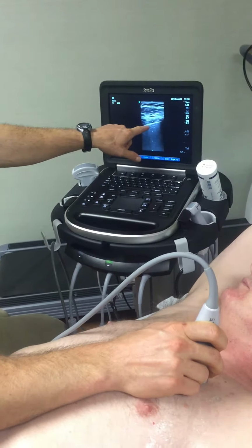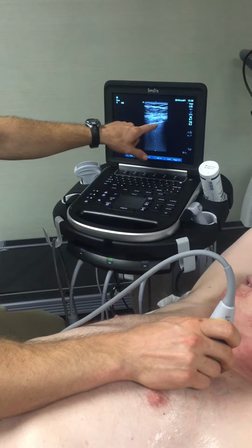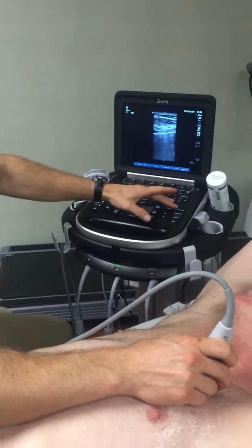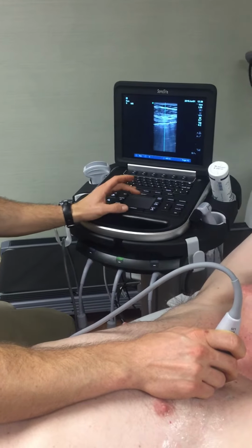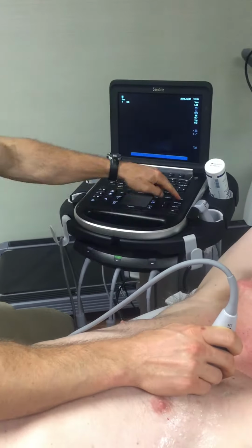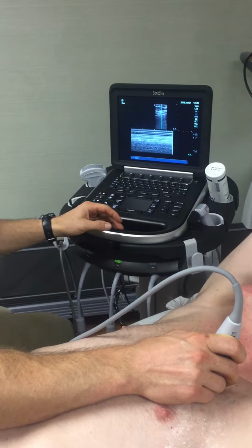You can see the low comet tails. Yep, and you can see the pleura sliding back and forth. Breathe normally. And then you can see that, but to confirm, you can also use M mode with this motion. You put the cursor over top of the pleura here. Hit M mode again, and this is when you see your seashore appearance.